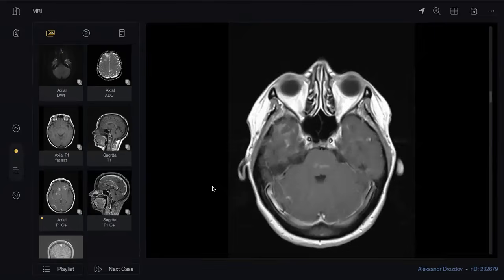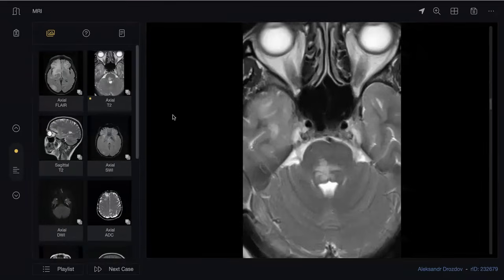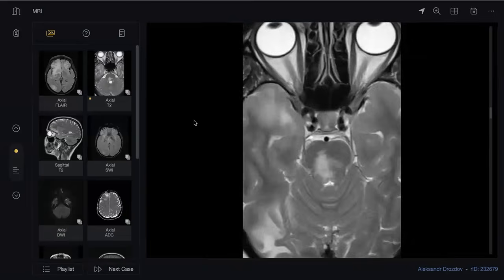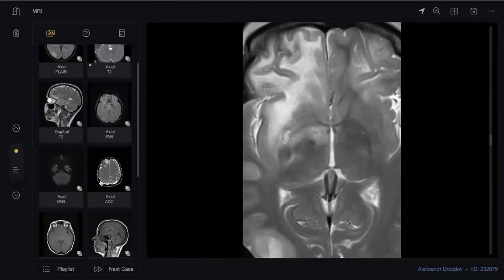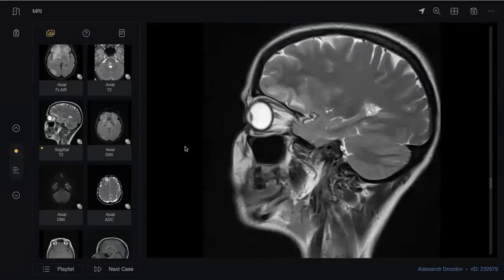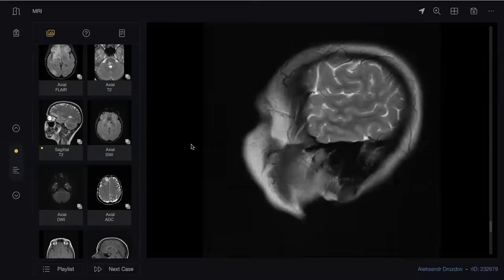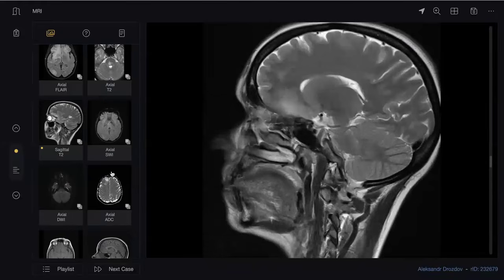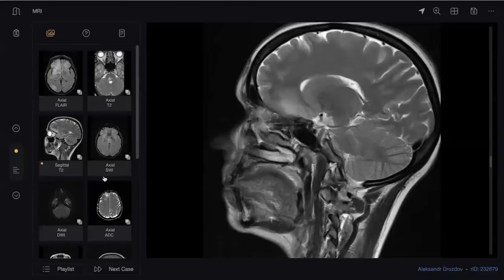The second mistake you made was that you were making up some findings, like optic nerves. Optic nerves are normal. You said later you're not sure. Then you said there is some thinning of the corpus callosum. So don't over speak in the exam. Sometimes it can land you in trouble. Otherwise, you made the diagnosis and you will pass this case.